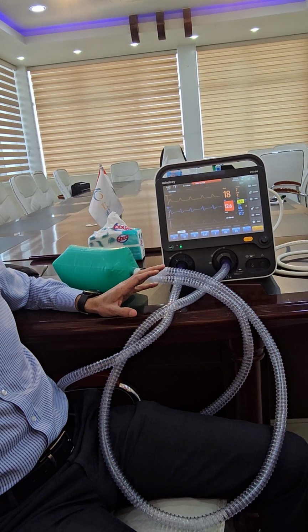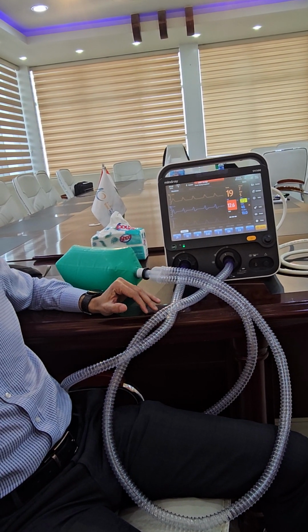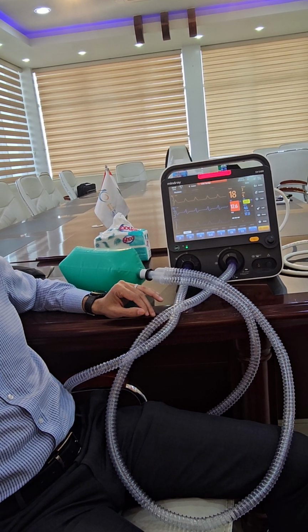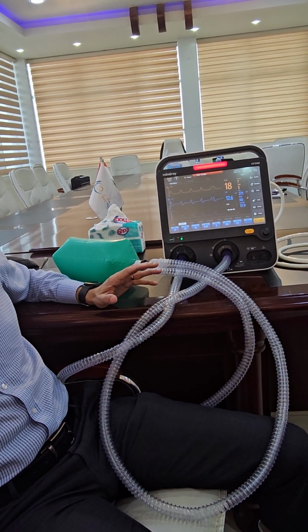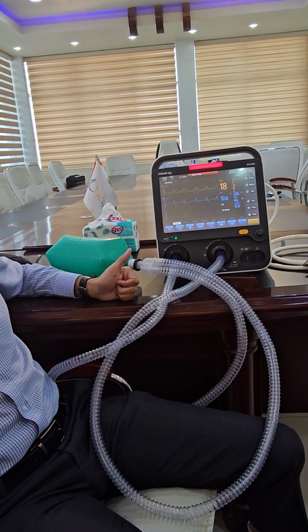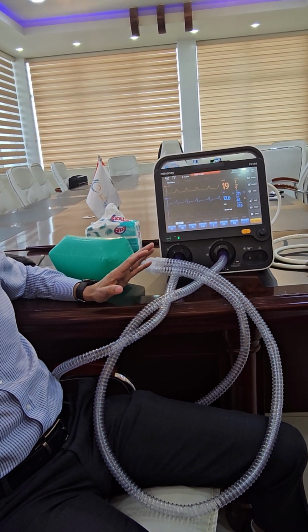Now when you use volume, you control volume. What remains not controlled? The pressure. So what type of trauma will that give you? Barotrauma. Remember, it's a pressure problem. If you control pressure, what will it give you? Volume trauma, a volume problem. Is it clear?